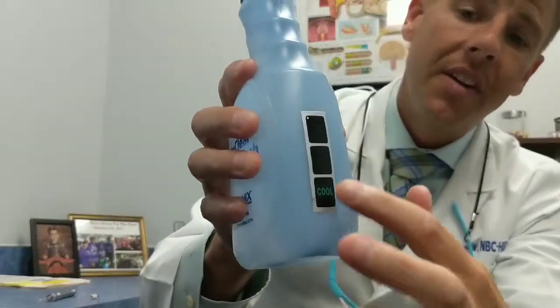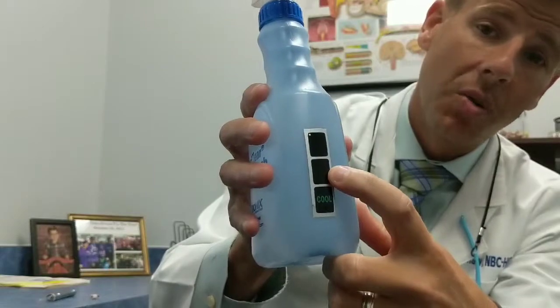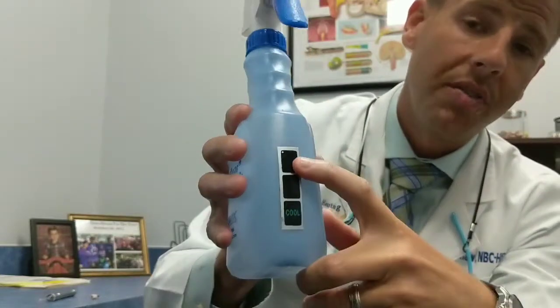When I go to lavage, I want to make sure that the water is nice and warm. Not only is it going to make removing the wax easier, but if I use room temperature or cold water, the patient can become dizzy or nauseous. You'll notice on these devices there's a little tag on the front — it will let me know if it's cool, okay (which is where I want to be), or too hot. If you don't have this, a full bottle is about a minute in the microwave and half a bottle is about 30 seconds.